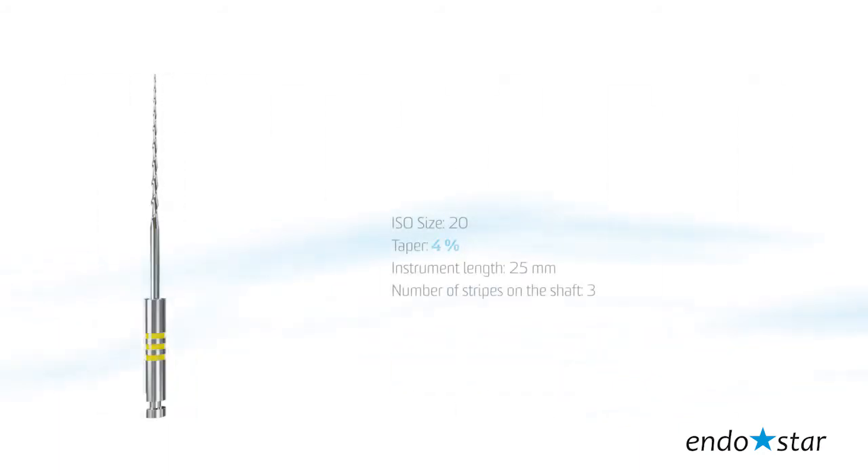File number 3: the tip size reflects 20 according to ISO standards, taper 4, instrument length 25 mm.